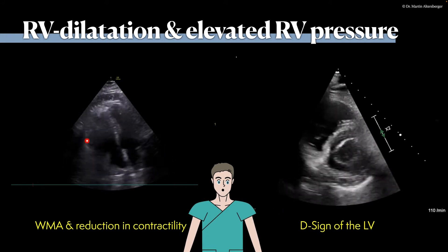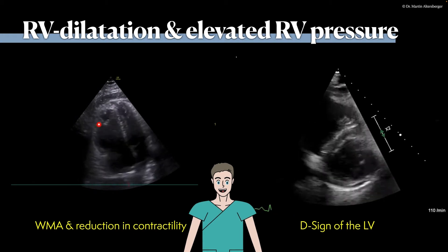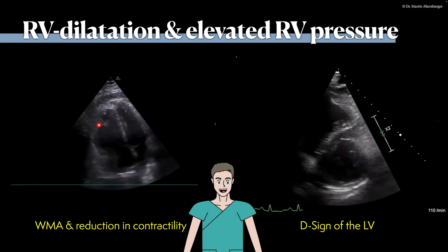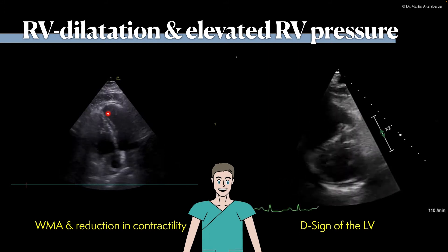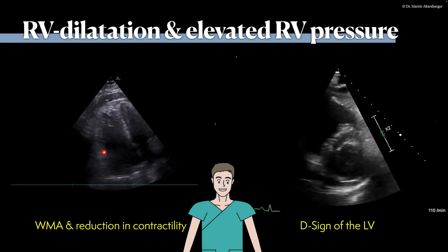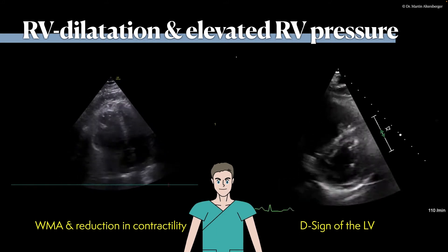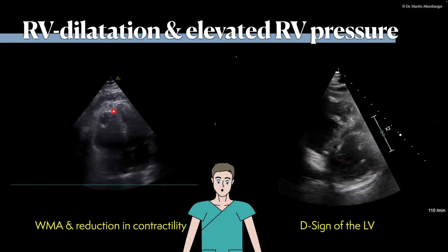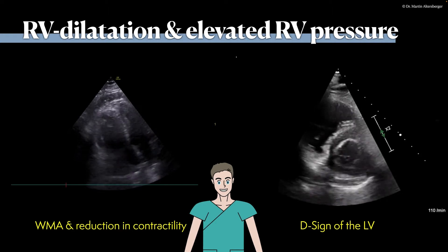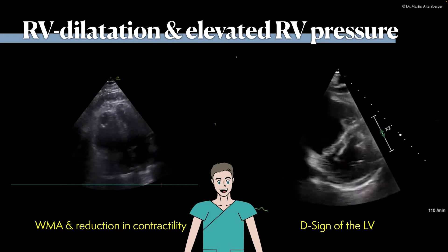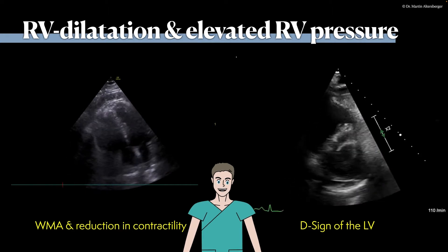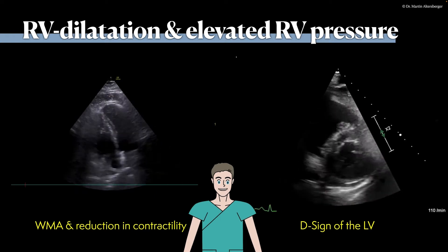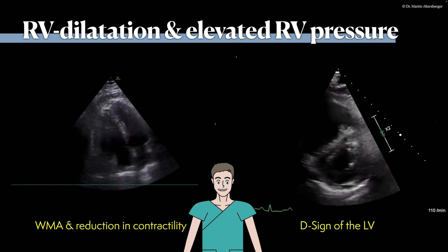We do see wall motion abnormalities of the right ventricle — especially the mid portions, which are akinetic or even dyskinetic. The apical and basal portions are contracting a bit better. Especially the apical portions are dragged towards the left ventricle, which is the contraction of the left ventricle. This is the so-called McConnell's sign.